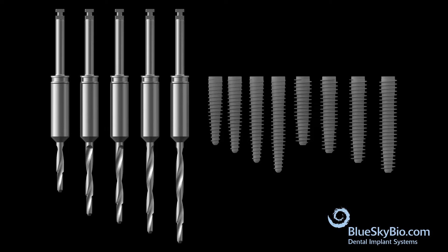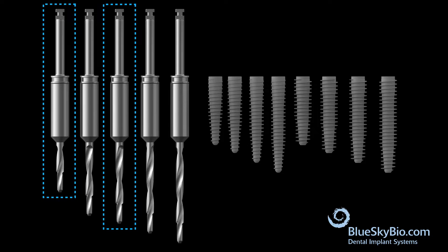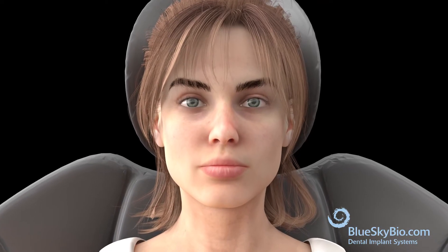Blue Sky Bios pterygoid implant system is meant for experienced implant clinicians. For this video, we are going to use the 12 millimeter P1 starter drill, the 22 millimeter P2 drill, and the 22 millimeter pterygoid implant.